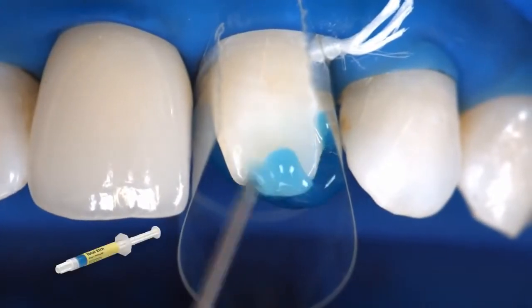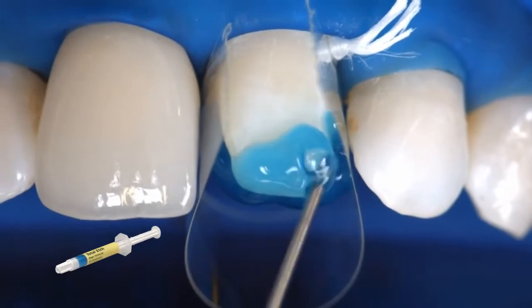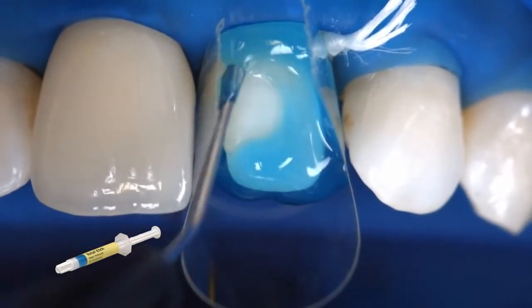Apply phosphoric acid gel, for example Total Etch, to the enamel and allow it to react for 15 to 30 seconds.